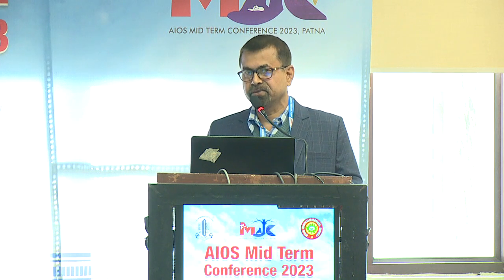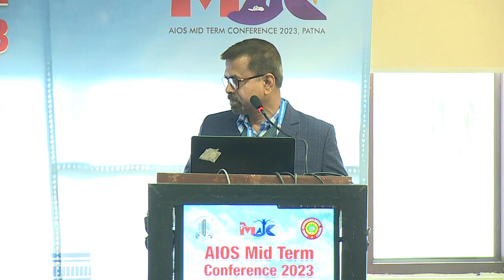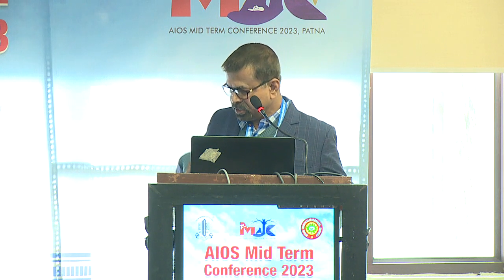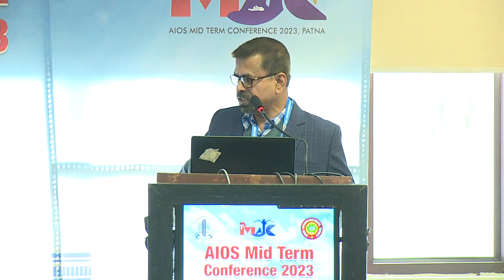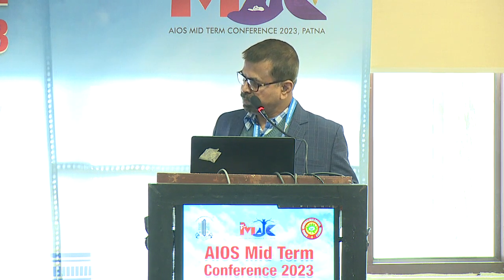Thank you very much. And also the place where you start, in the center or do you move towards the incision? Does it make a difference? Just in front of the main incision. Main incision. So in that front, you go downwards, go deep towards the center. Downward, then at a deeper plane horizontally.